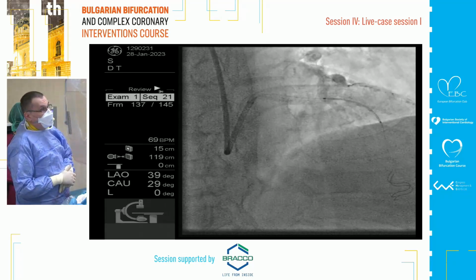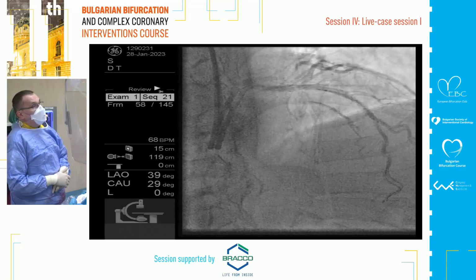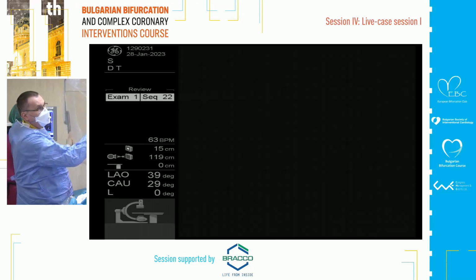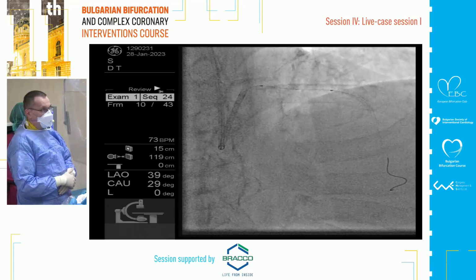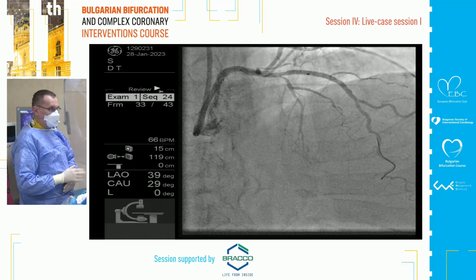I would suggest not to be too close to the distal bifurcation. No, it is not. Because my colleague Thierry said you missed the bifurcation, so don't do that. Either you cross, or either you enter the bifurcation. Then you are going for 3 stents, if this is the result. Yeah, that's good. That's good.